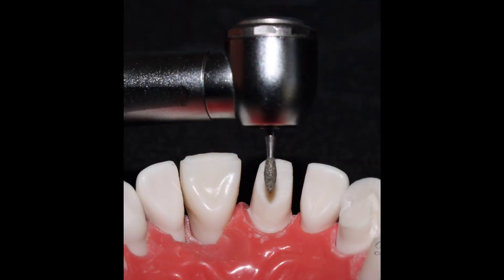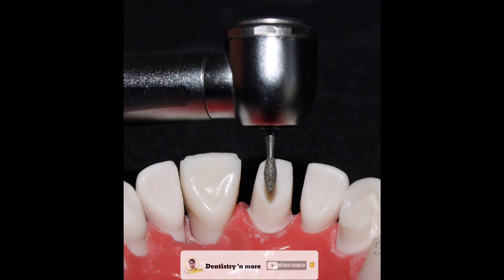I remove any small undercuts or steps in the preparation. The lingual fossa reduction is done using an American football diamond burr, placed parallel to the long axis of the tooth — this rule does not change at any step of the preparation. The lingual fossa reduction needs to be done smoothly and only to a certain extent — you do not have to overdo it. Once the fossa reduction is done, the lingual preparation is complete.